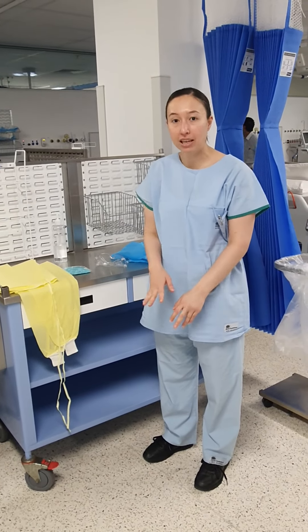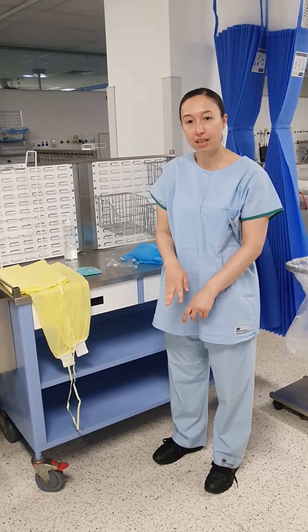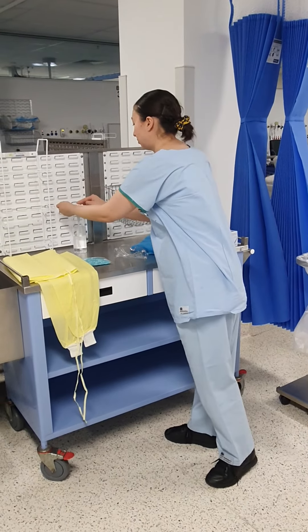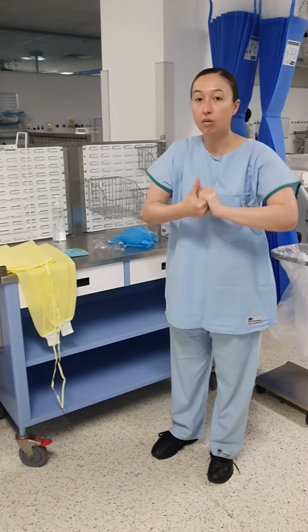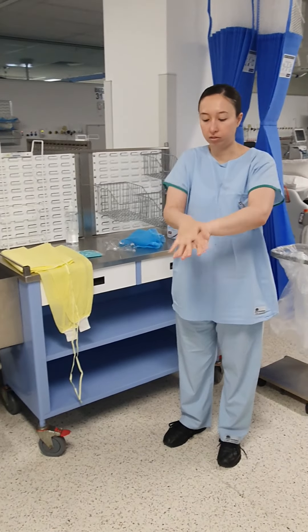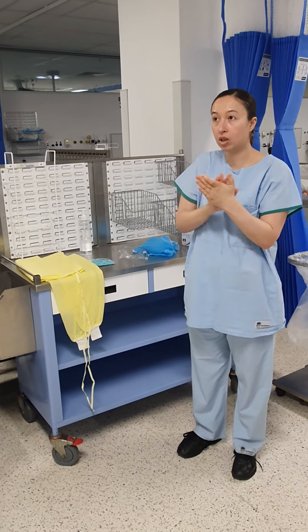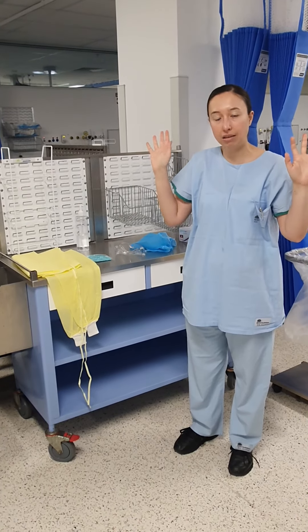Hello, I'm going to go through the donning and doffing process when caring for COVID-19 patients. The first step is to perform hand hygiene. Rub it until it's dry. Okay, so my hands are dry.